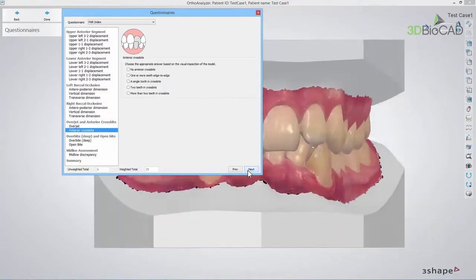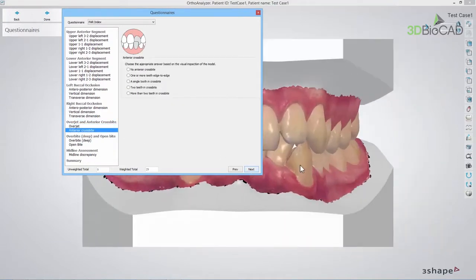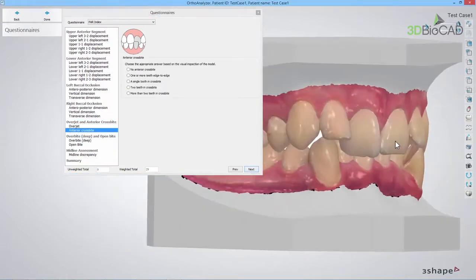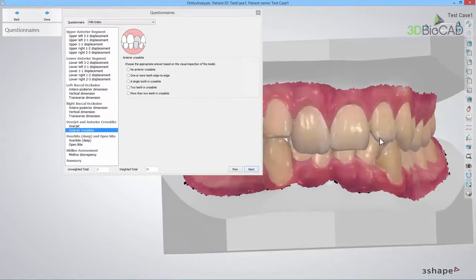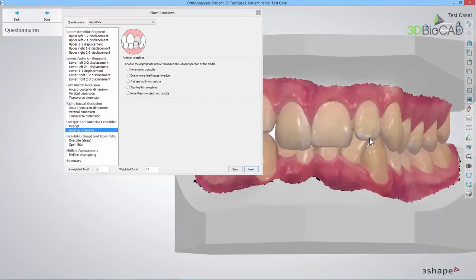The last step is Anterior Crossbite. Here you should also inspect the model and choose the appropriate answer.